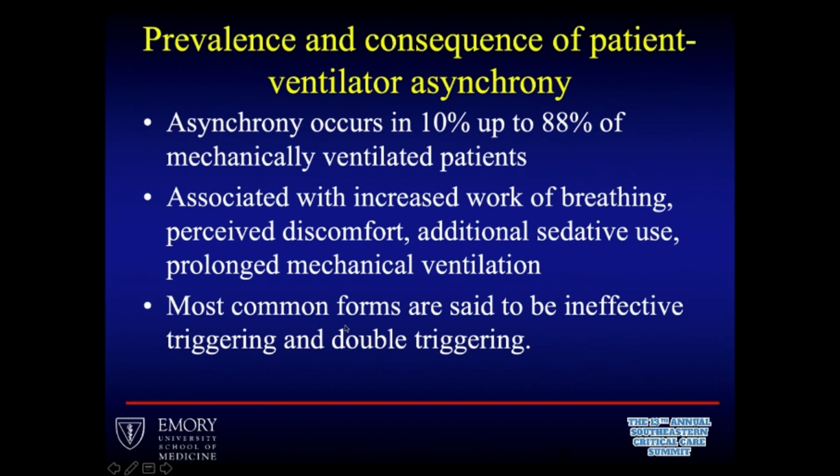So what happens when things don't go as planned? Asynchrony or dissynchrony occurs in what, 10 to 88% of mechanically ventilated patients? How can that be? Well, it depends on how hard you look. And so the more you look, the more you find. Some studies use esophageal balloons to detect patients' efforts, and they're going to find more dissynchrony.